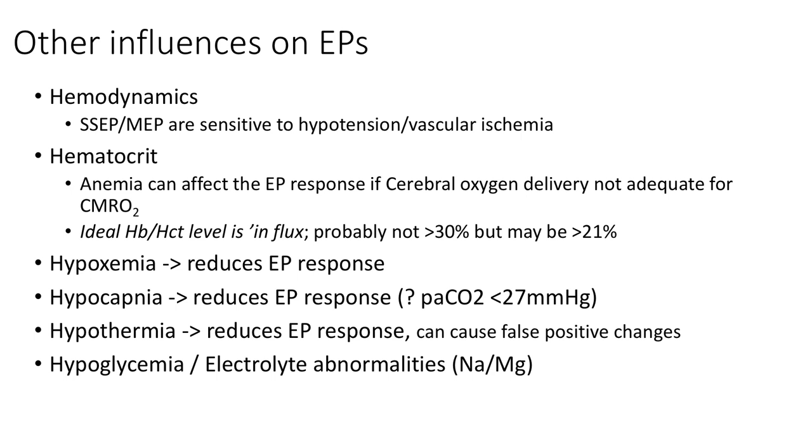Several studies have documented sensitivity and specificity approaching 100% when it comes to multimodal monitoring, the combination of SSEPs and MEPs for spinal cord surgery. So both those methods together probably have a very high reliability to detect new spinal cord deficits.